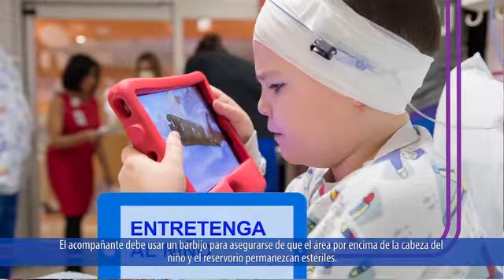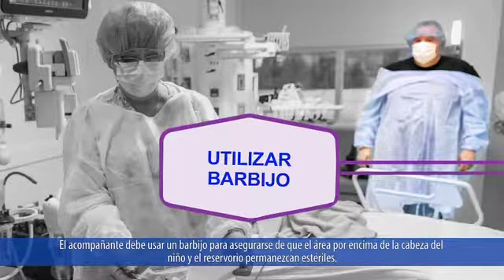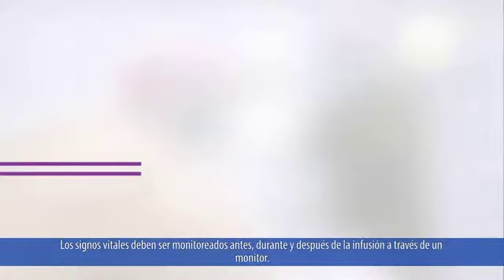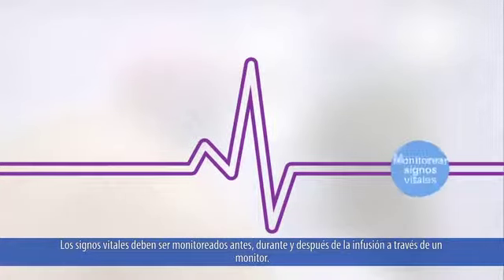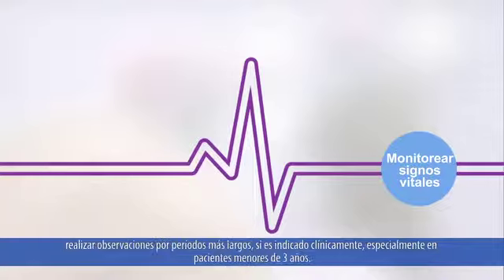The caregiver should consider wearing a mask to ensure the area above the child's head and the reservoir remains sterile. Vital signs should be monitored before, during and after the infusion in a healthcare setting. Upon completion of the infusion, the patient's status should be clinically assessed and observation may be necessary for longer periods if clinically indicated, particularly in patients less than 3 years old.